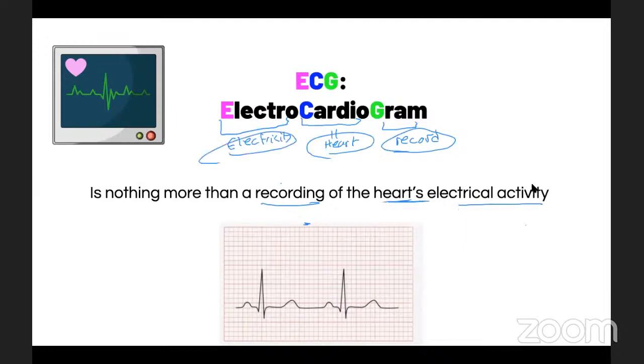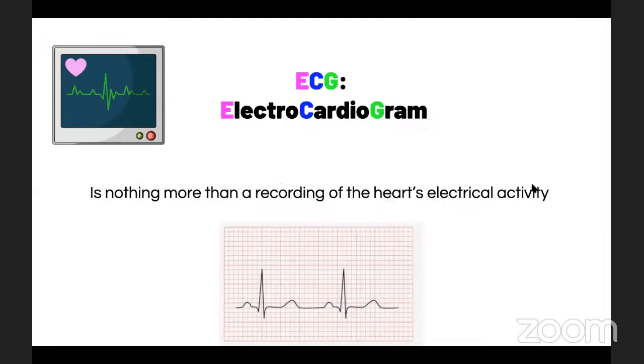It comes from the name itself. But I'm going to add to the definition that it's read on the ECG paper right here in pink, and then by the ECG machine. And we need leads and electrodes for that. And we'll discuss the electrodes by the end of the talk.